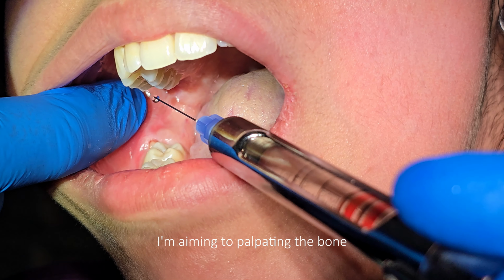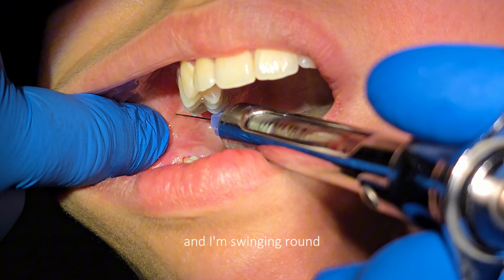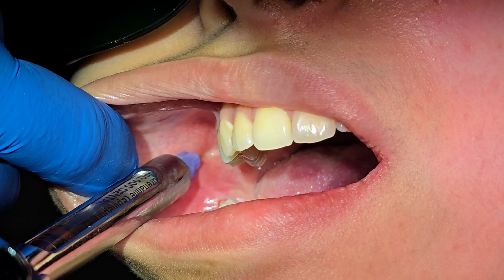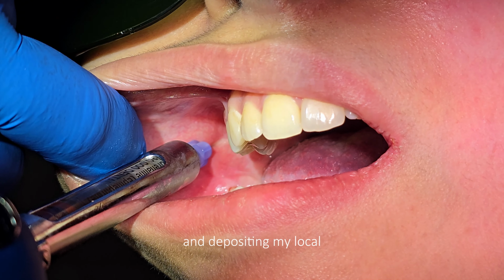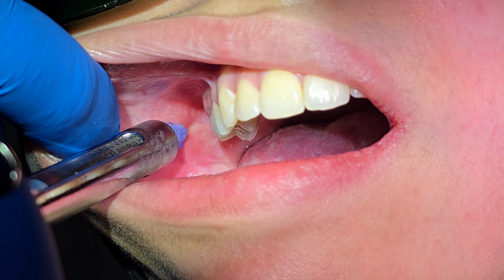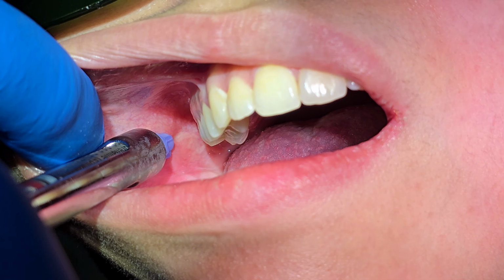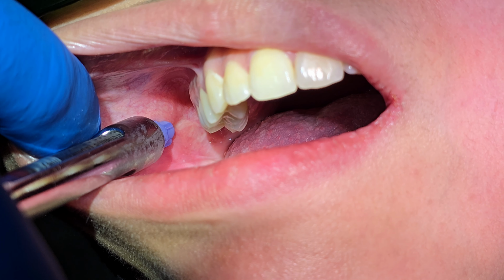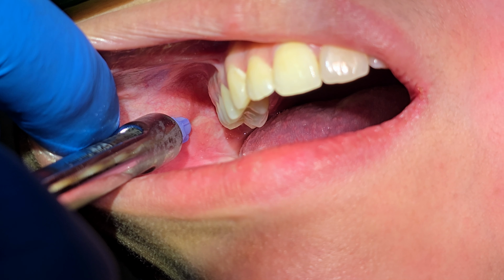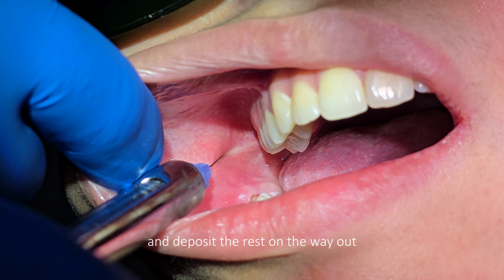Technique, I use an indirect technique. I'm aiming to palpate the bone, going halfway between the top and bottom teeth, pinch, hitting bone almost immediately, and I'm swinging round and inserting about 2/3 of the way in and depositing my local. And deposit the rest on the way out for the lingual nerve.